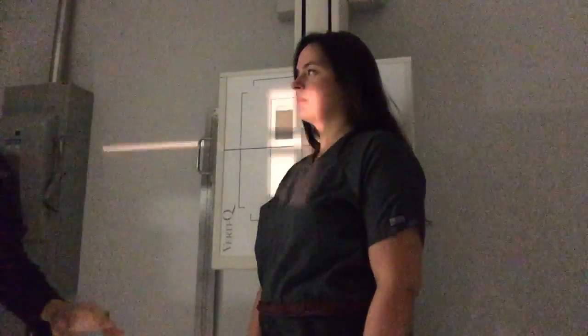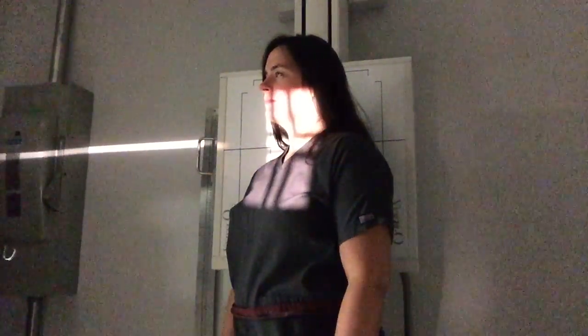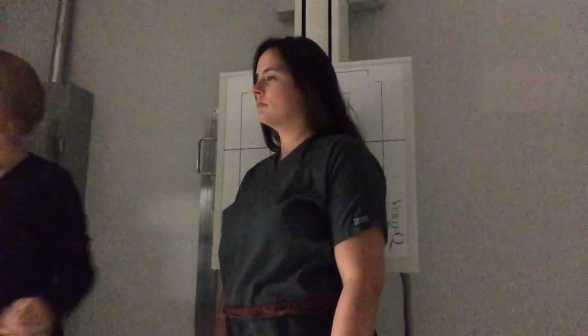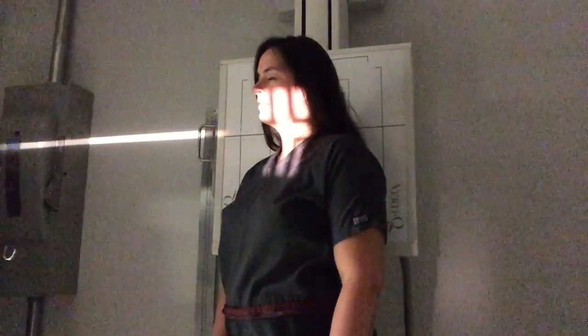Turn your patient at about a 45 degree angle and put your central ray right at the Adam's apple. My patient has her right side up against the IR, so we're going to use the right marker because we mark the side closest to the IR. Collimate in both directions and place the right marker. I'm going to expose at 85 kVp and have my patient hold her breath.